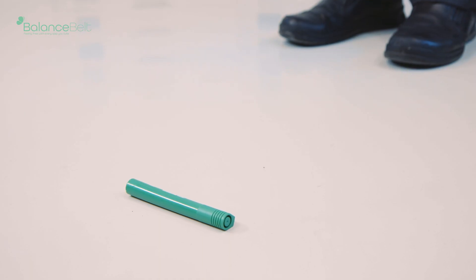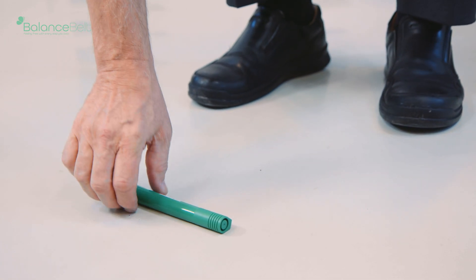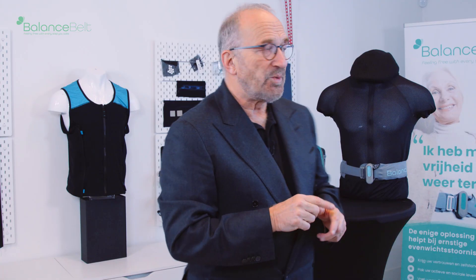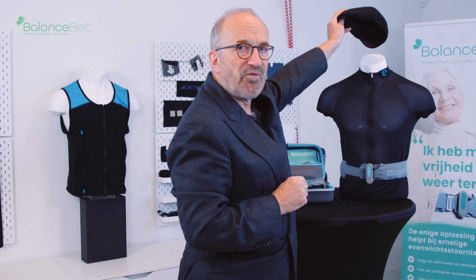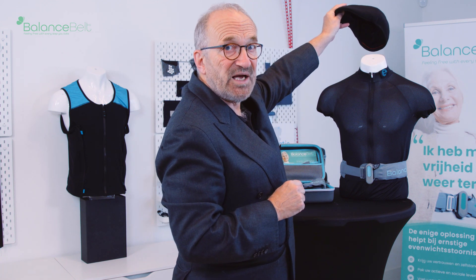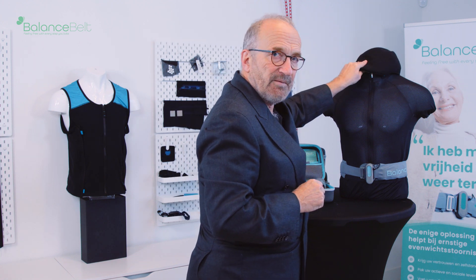Two other tests that you can apply. One is to let them walk and while they are walking ask them to stop and pick up something from the floor and go back. The last test is to ask them to walk towards a place and then tilt something from a high-placed shelf and put it back again. Many patients with an impaired vestibular system have problems with these things.